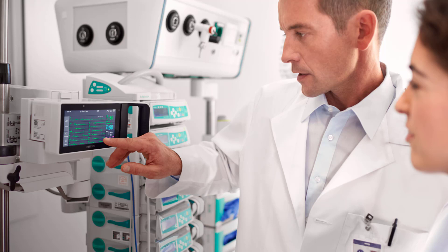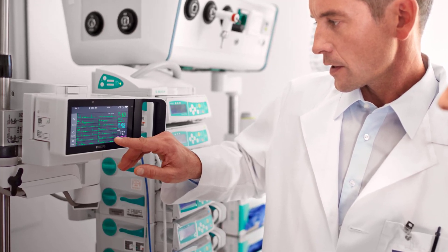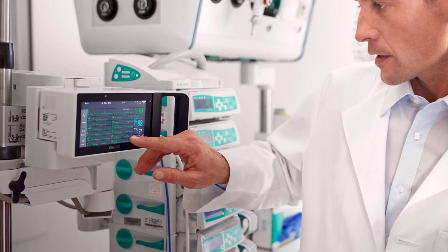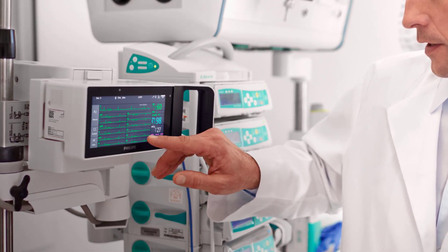Welcome to the Philips Intelliview Patient Monitoring Microlearnings. In this video, I will walk you through the basic operation of the X3 multi-measurement module. Let's get started.